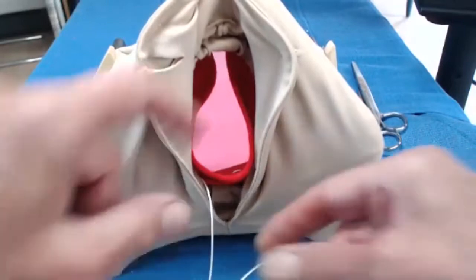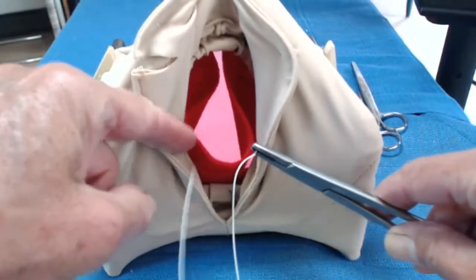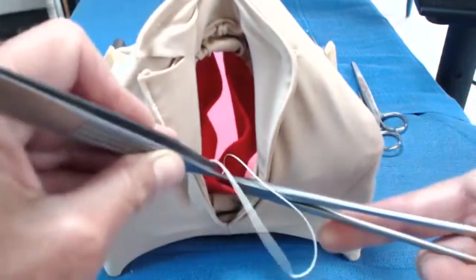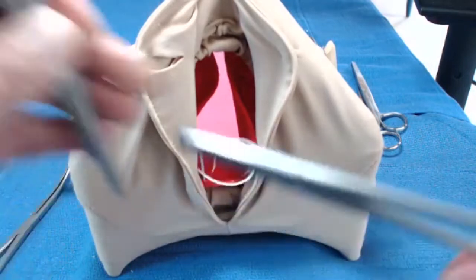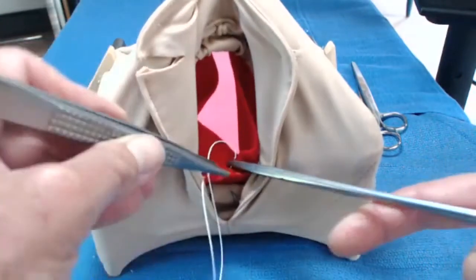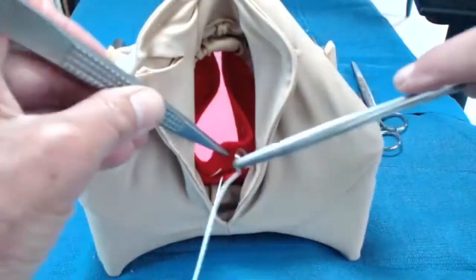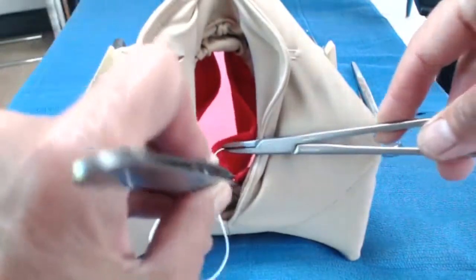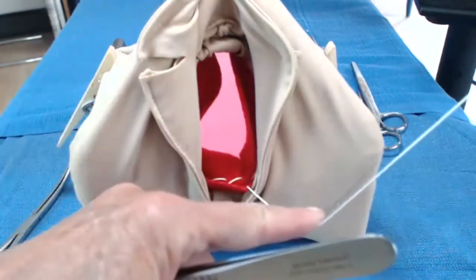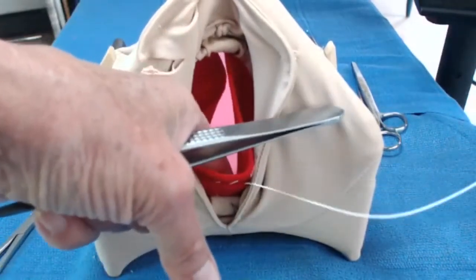All right, so now I've got it pulled back together somewhat, but you can see there's still a pocket here. So I'm going to do a second layer using the same stitch but coming back across more superficially, taking care that I don't lock a stitch and that I've secured all areas that might be bleeding. The angle of this is a little bit challenging because I have a solid table under me — if you have such a tear I would strongly urge you to break the bed or otherwise have the client's bottom all the way at the edge of the bed. So this would close this pocket tear.